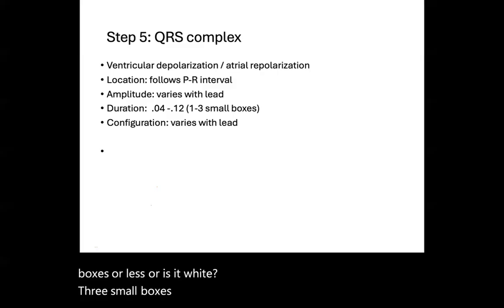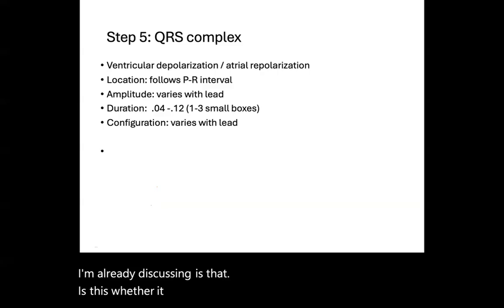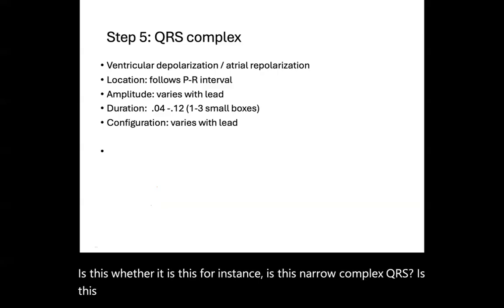And then the algorithm, which I might share, is: is this a narrow complex QRS? Is this a narrow QRS complex? Is it regular or irregular? If it is regular, it's a different diagnosis than when it is irregular.